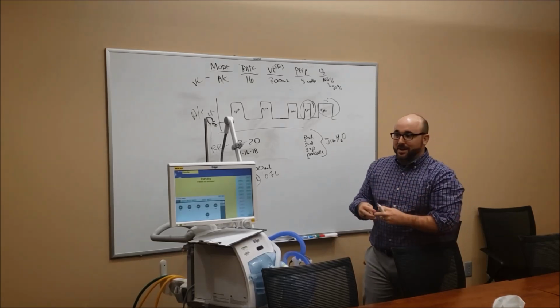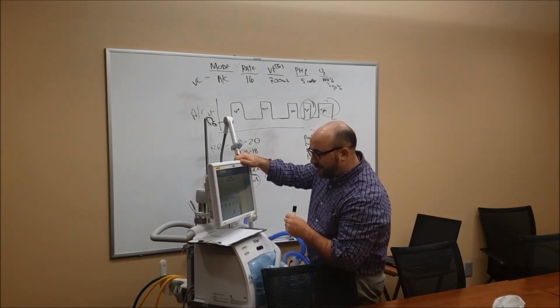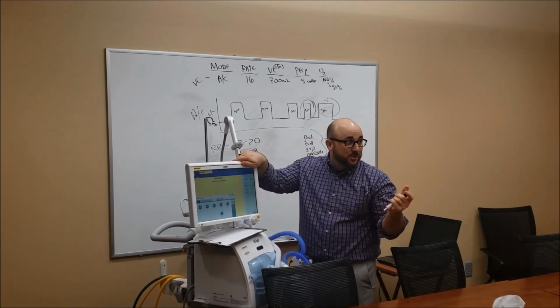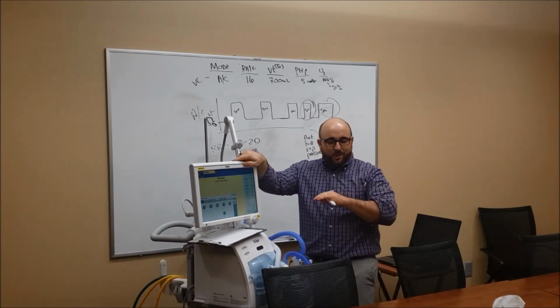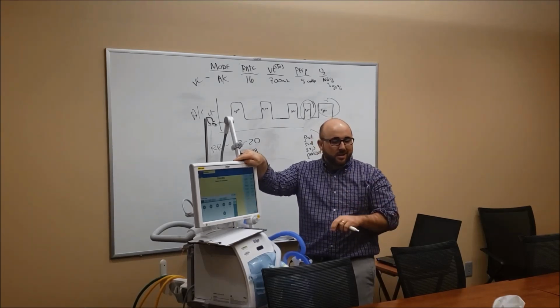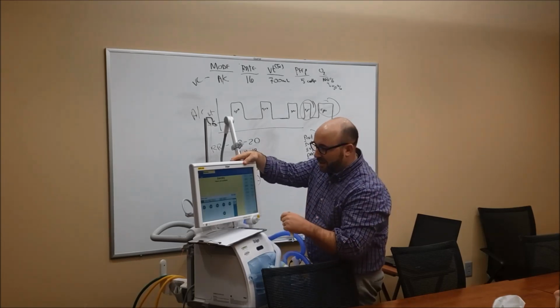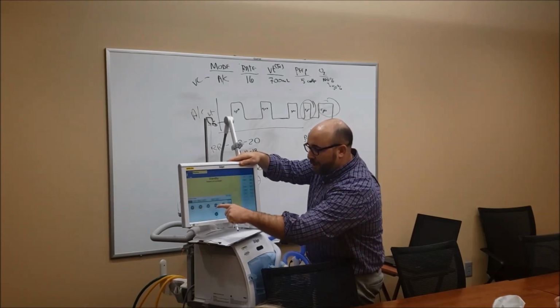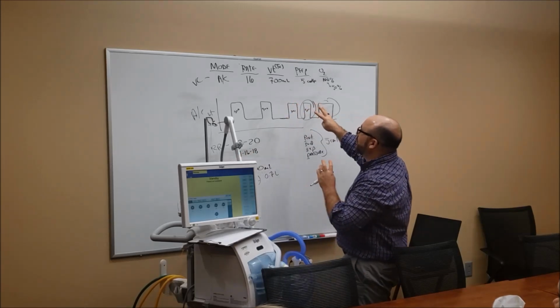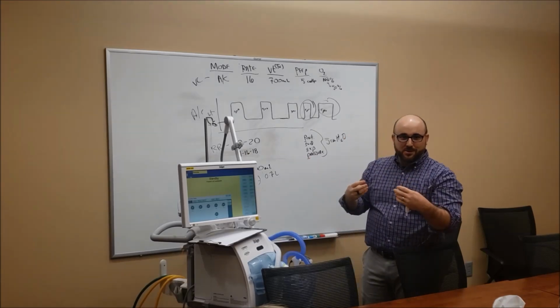So it will help you a lot, because what a lot of people do is they go through this and they say FiO2 is 55, tidal volume is 350, TI is 0.94, and that's what you were asking about, the TI. We don't even give that in a report. It's something that we manipulate to adjust how fast the breath goes in. The nurses upstairs and you guys don't even care about that stuff. So it's just an RT thing. Respiratory rate and then PEEP. So you can see how they're like, all this stuff you're giving me doesn't fall into this normal reporting mode that we're used to, okay?